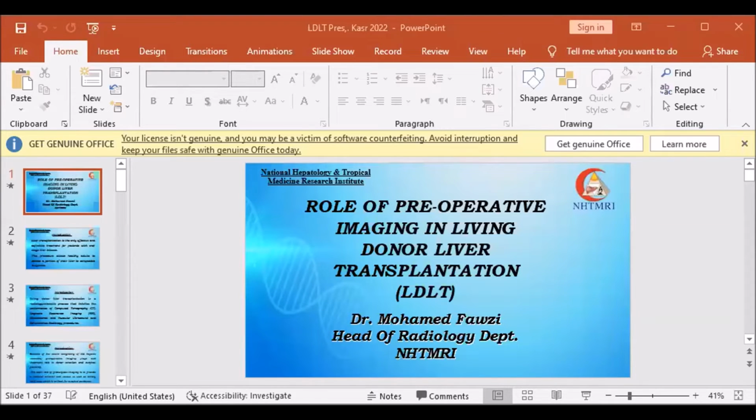In the venous dominant phase also, you have to clearly opacify the hepatic veins by themselves. And this is now becoming of importance, to clearly opacify the hepatic veins in order to do a hepatic venography after that, where you can do a volume image and you can see the venous system of the whole liver. And as you usually take the right lobe, you can see the red vein here, which is called the inferior right. This is a volume rendering image, inferior right hepatic vein. And according to its size, diameter, as we see here in the image, the surgeon decides whether he's going to anastomose it to the IVC or not.